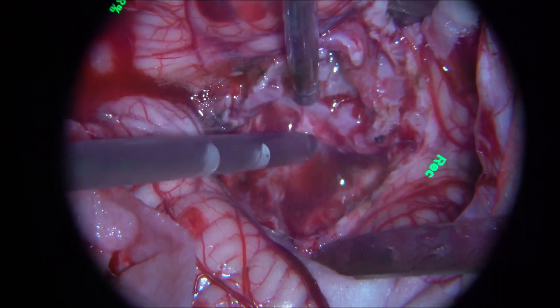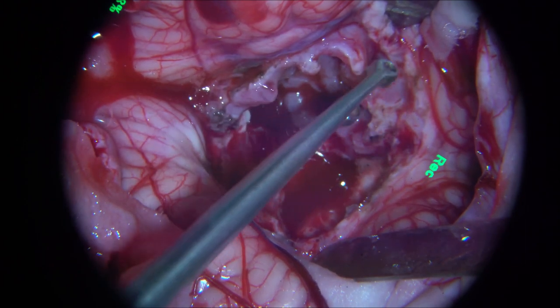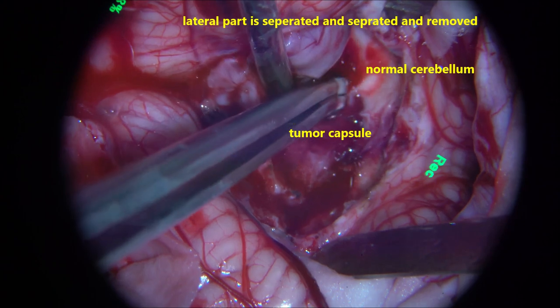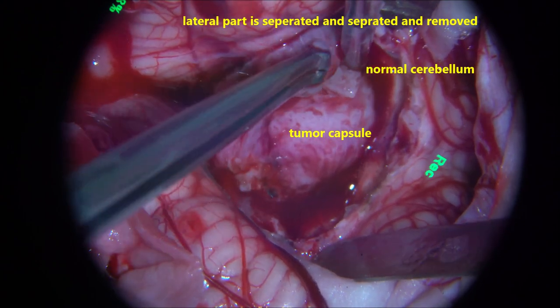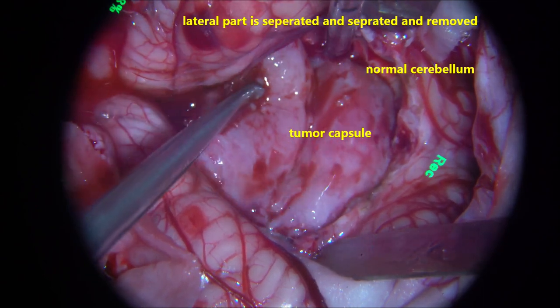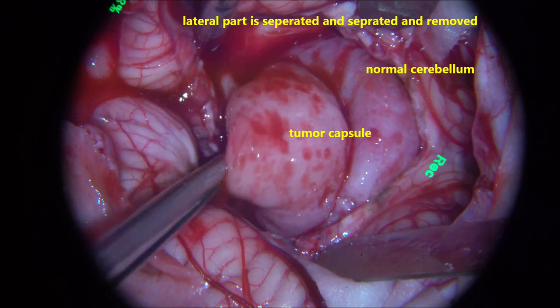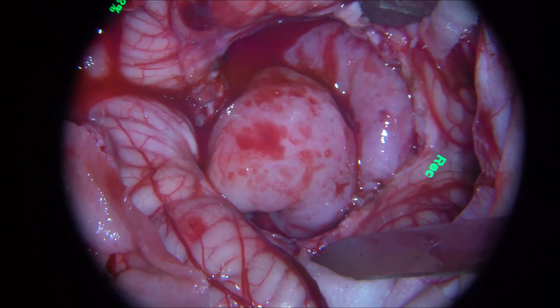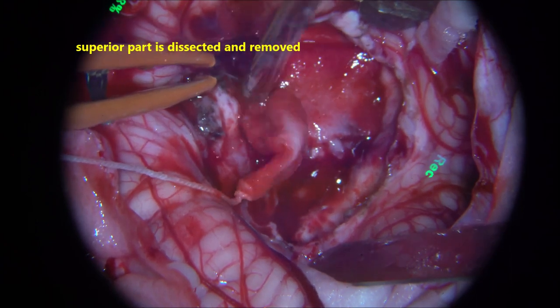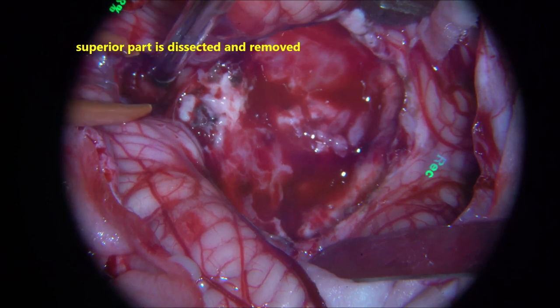That is the middle and superior part of the tumour. As seen on the MRI, it is a multilobulated tumour with multiple compartments. Once the internal decompression is done, you can see the lateral part of the tumour on the right side. As you start gently pulling it out, the tumour starts separating from the normal brain and cerebellum. There is a very good plane of cleavage between the tumour and the cerebellum. The major bulk on the right side is dissected, separated, and removed. The tumour bed vascularity is coagulated and hemostasis is achieved. It is always better to achieve hemostasis before proceeding to the next quadrant.